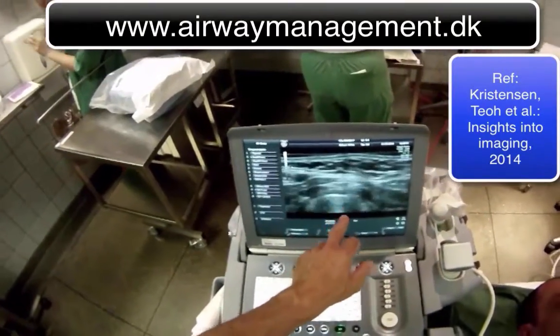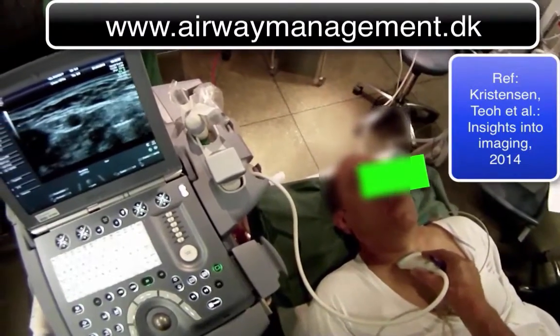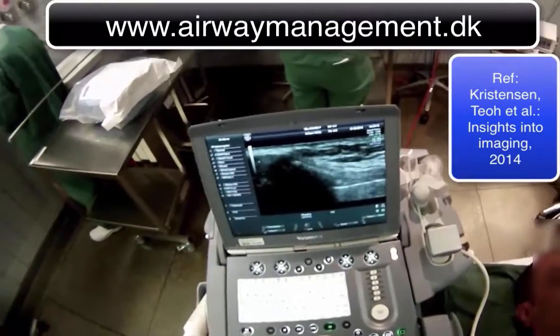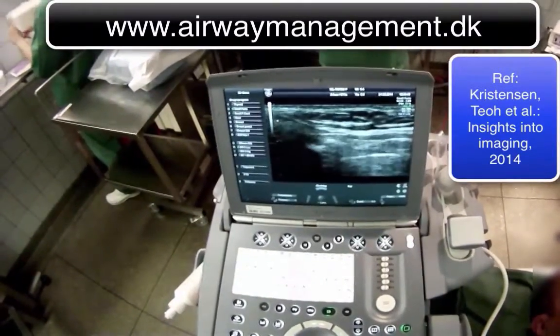There it is. Slide the transducer left and turn it into the sagittal position. Now you've got the midline of the trachea.